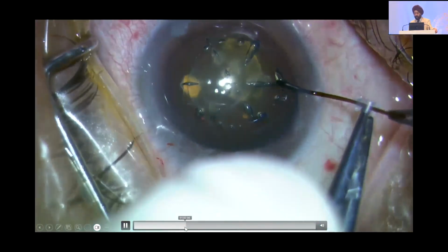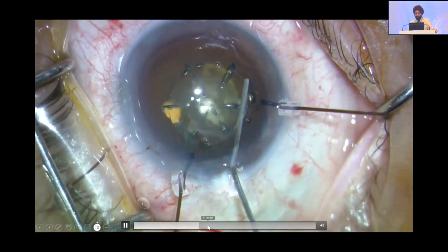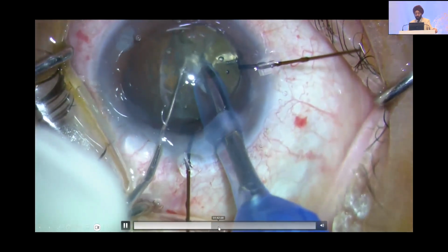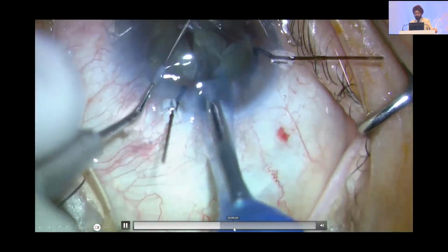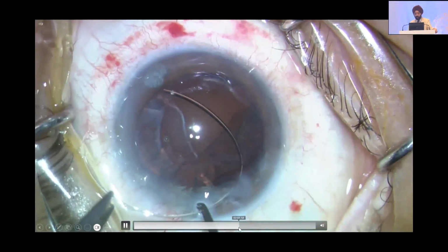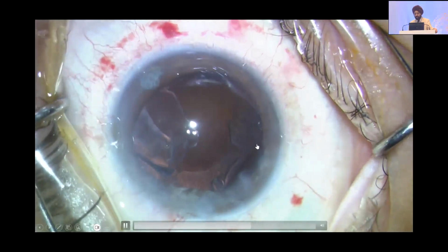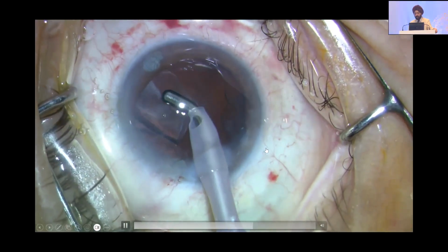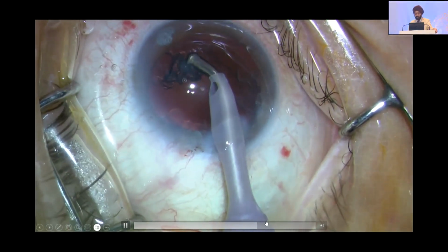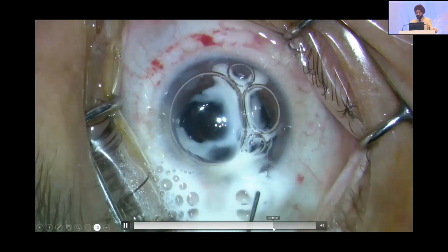These are the capsular hooks that we are putting in this particular case. You can see this is a capsular hook again, gentle hydrodissection which is done, pre-chopped nucleus, so you are able to have a good nucleotomy with the femto, and again slow motion phaco, you are able to remove the pieces of the nucleus, putting in a CTR. Because this is less than 6 clock hours, you don't need to put in a fixation with a suture. A CTR will hold, and now you can again see this is a 3-piece lens that we have. It will again give you more stability.